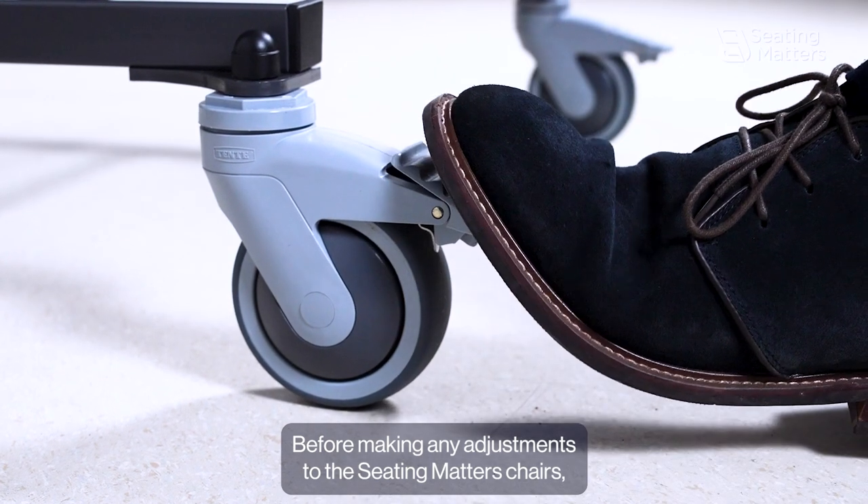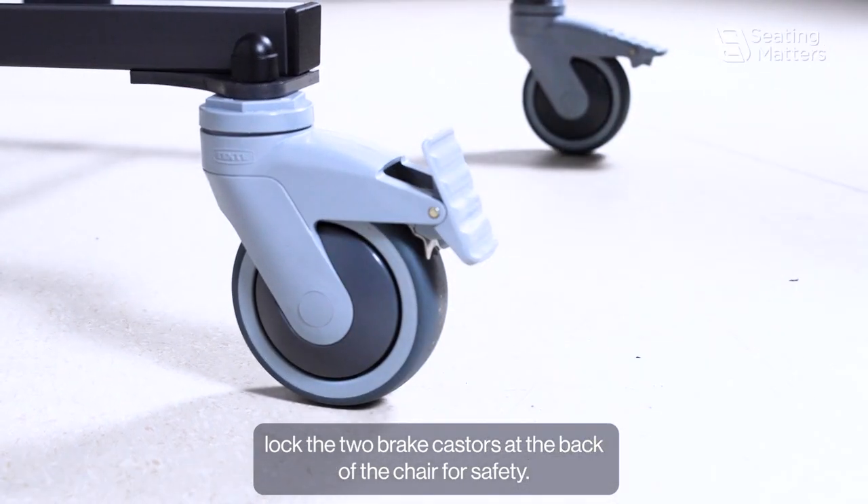Before making any adjustments to the seat mattress or chairs, lock the two brake casters at the back of the chair for safety.